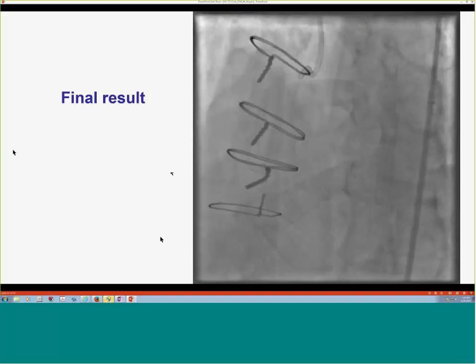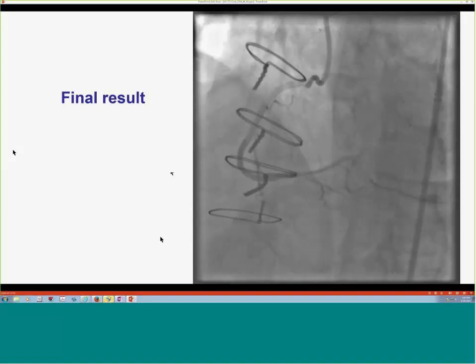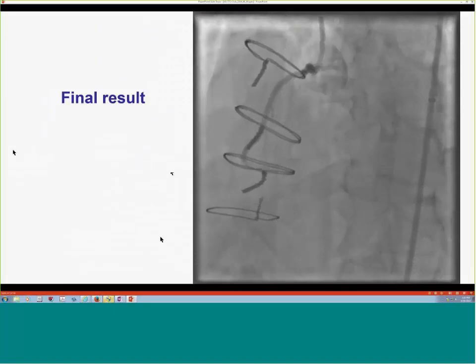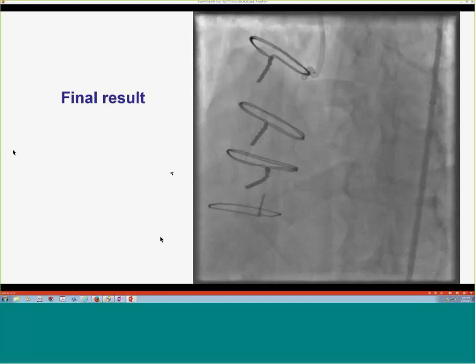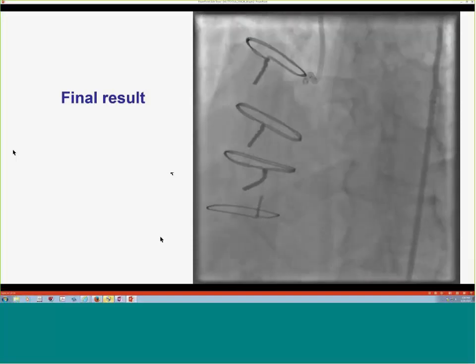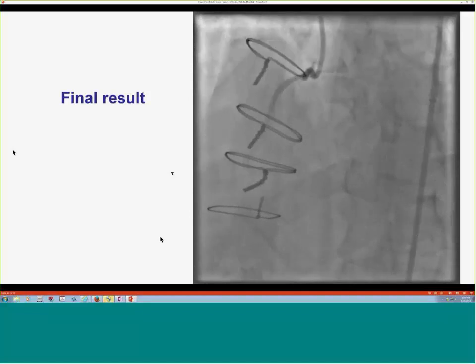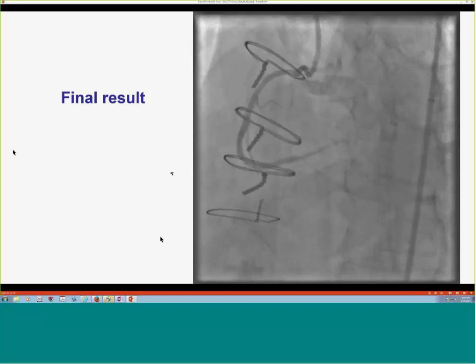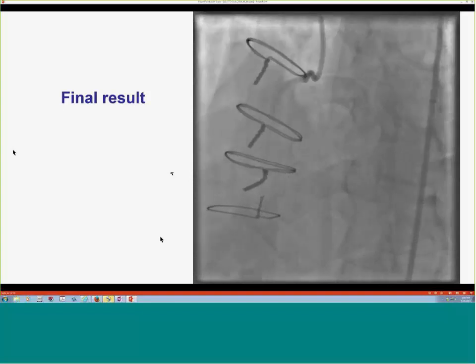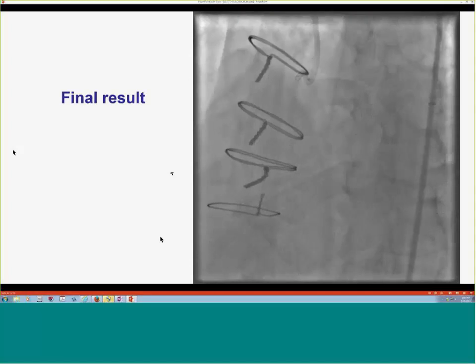Greg, do you fastidiously try to get the balloon to be in the right plane? What I mean is, if you're going to go on both poles, you try to get the balloon to be one rather than two. Oh yeah, if I can. But sometimes if I cannot, then I just do my best and I try to see the wire exit between the two markers or before the first marker, if I can. And the big thing, what I see most people have difficulty with, is if you put too big of a bend in the pilot, it's a problem. It doesn't exit the side ports. It has to be a very, very small bend, similar to the Stingray bend.